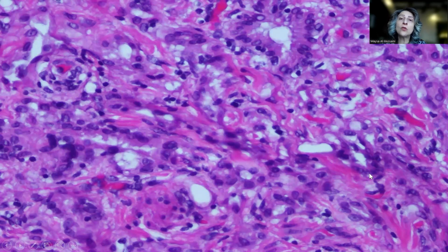The differential diagnosis here is adenomatoid tumor, but remember the patient has breast carcinoma for which she underwent the risk-reducing surgery. So breast carcinoma, metastatic carcinoma, should always come in the differential diagnosis and should be sorted out.